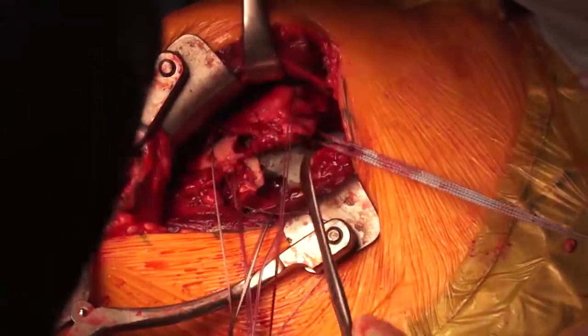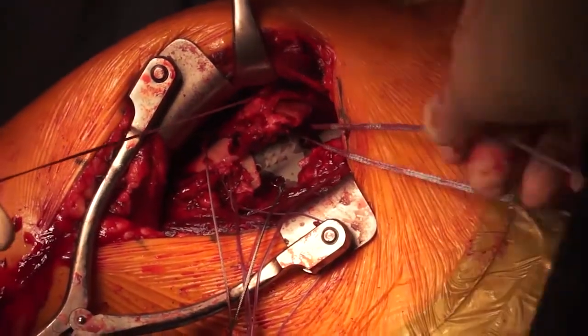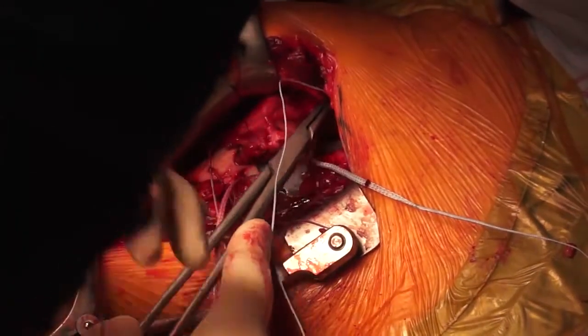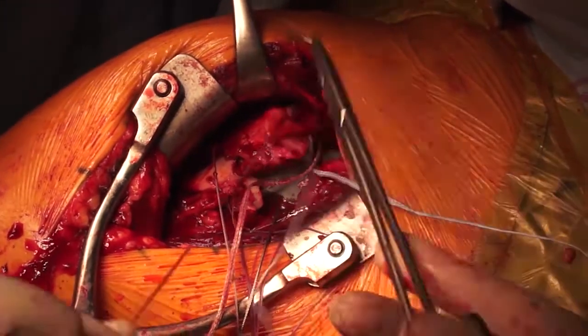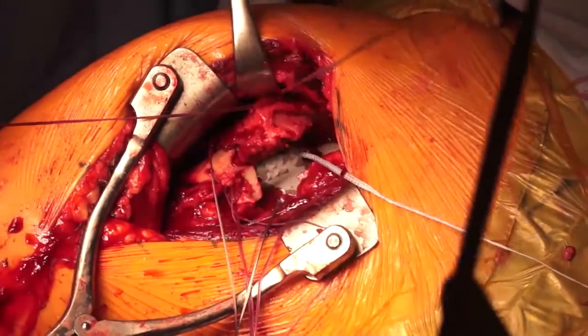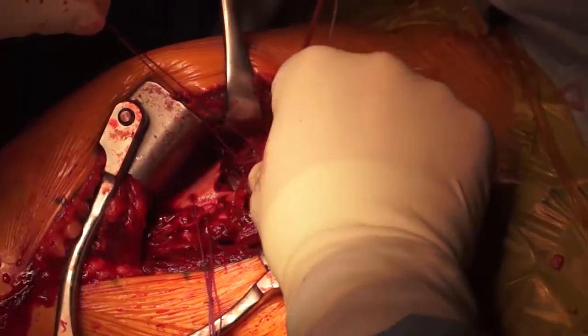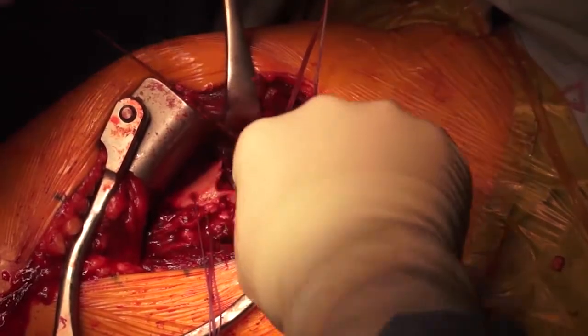Repositioning the tuberosities while avoiding excessive tension. The upper suture is tied through the front edge of the infraspinatus tendon and through the upper edge of the subscapularis tendon. Tension-free repositioning of the tuberosities to the implant body. The intertubercular sutures are tied.